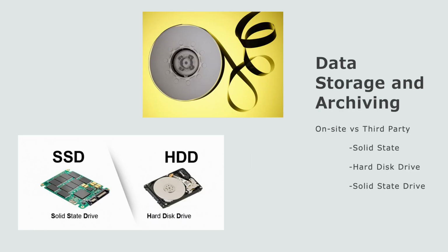If a lab runs 10 studies a week, that's 520 studies a year. If every study is 2.5 gigabytes big, that's 1,300 gigabytes of data, or 1.3 terabytes, and that's being fairly conservative as far as studies go. Studies can take up more space, and labs probably run more than 10 studies a week. Some run at least 10 a night. That's a lot of data. And there are rules saying you have to save studies for so many years. You can do certain things like delete the video after a month to cut down on space, but that only goes so far.